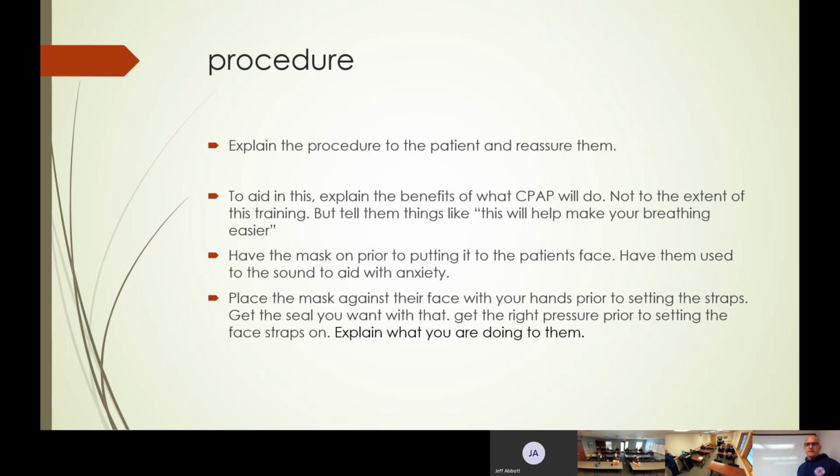To aid in this, explain what CPAP will do. We don't need to break it down to the scientific level. Just let them know this is going to force air into your lungs and help you breathe a little bit easier. It's going to take some of the work off of your body to breathe. Have the mask on prior to putting it to the patient's face. You want to have them hear the sound so they can understand. Say, this is what it's going to sound like. You're going to feel it.